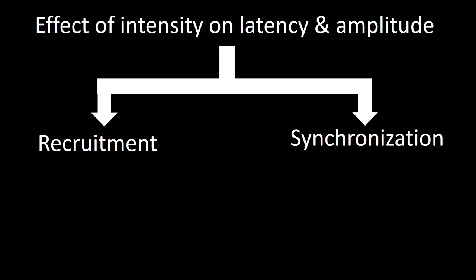Intensity influences latency and amplitude by modifying recruitment and synchronization.